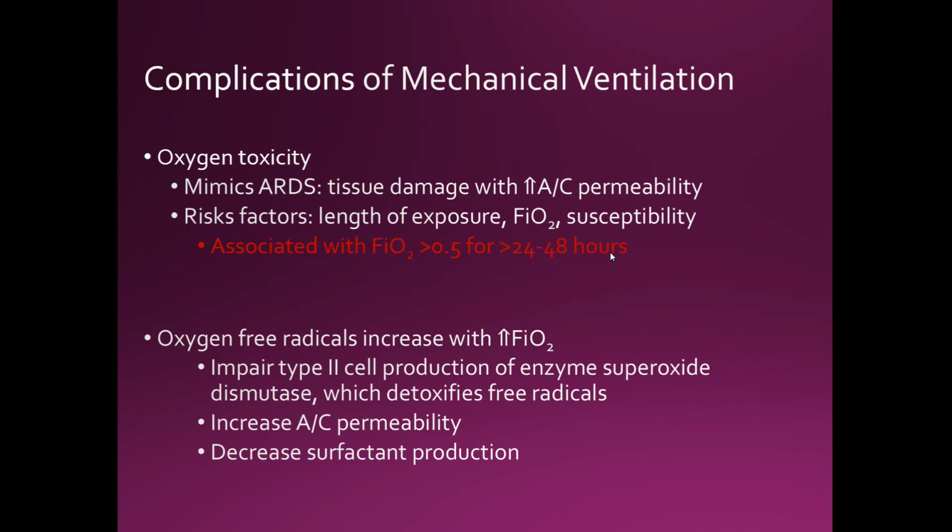If you give a breathing treatment to a patient on mechanical ventilation, your tidal volume is going to rise significantly. You might see it at 1200, 1500. Don't be scared. It's the small volume nebulizer.